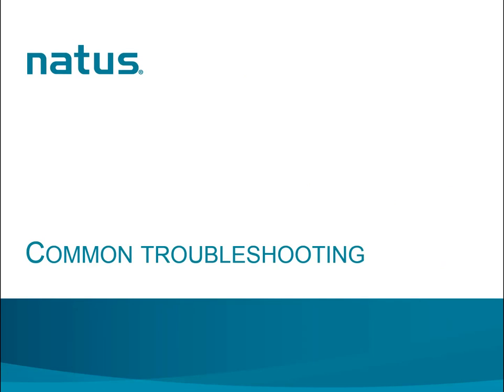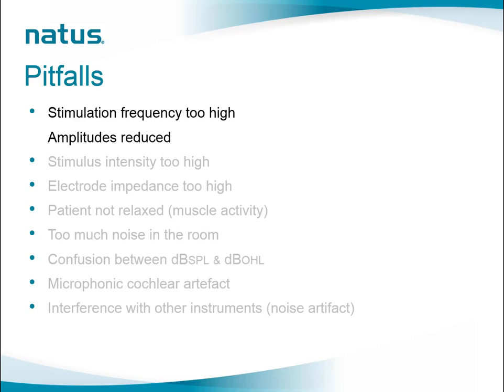So finally, I want to discuss what goes wrong when we perform AEPs, because in those presentations we always show how the waveforms should be and so on. However, in real life we may have issues sometimes. So let's talk about the pitfalls.